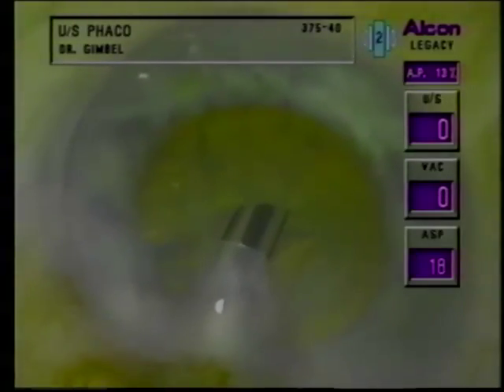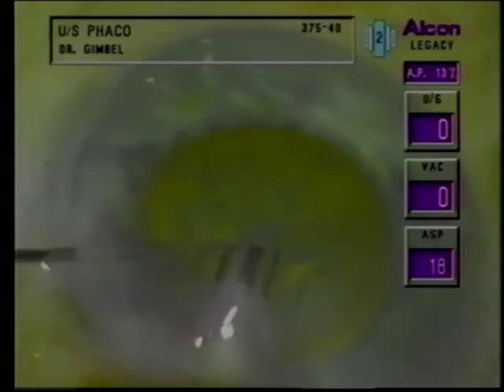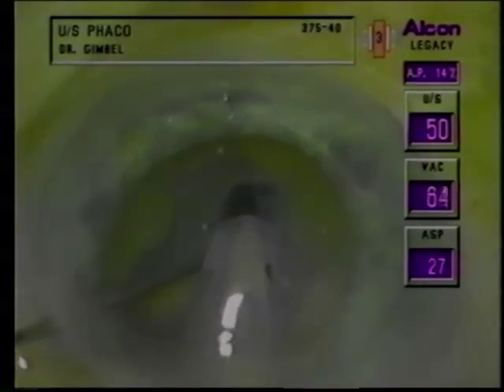For entry through the incision I turn the Kelman tip on its side. Notice the position of the irrigating sleeve one and a half to two millimeters back from the bevel. This helps ensure that with a scleral tunnel and corneal entry the irrigation ports will always remain in the eye. I turn the Kelman tip down to begin debulking the superior portion of the lens. Because of its angle, the tip enhances the emulsification process by its shear cutting forces. Notice that the parameters for the Alcon Series 20,000 Legacy are displayed on the right-hand side of the screen.